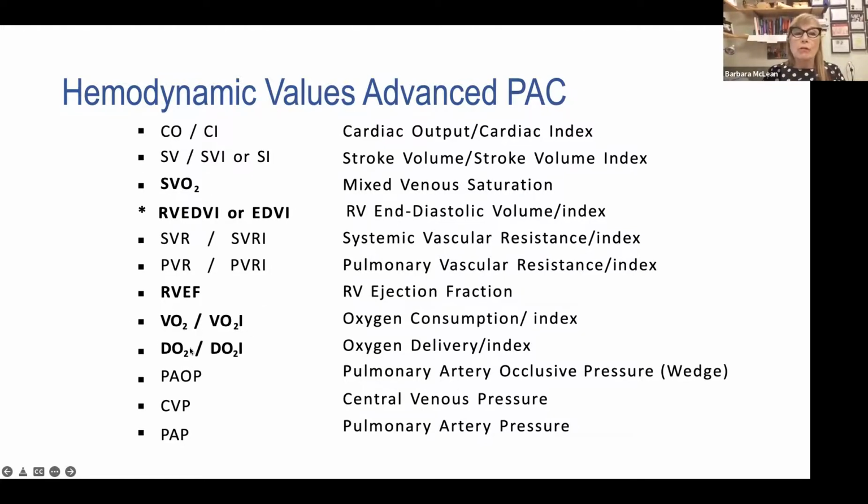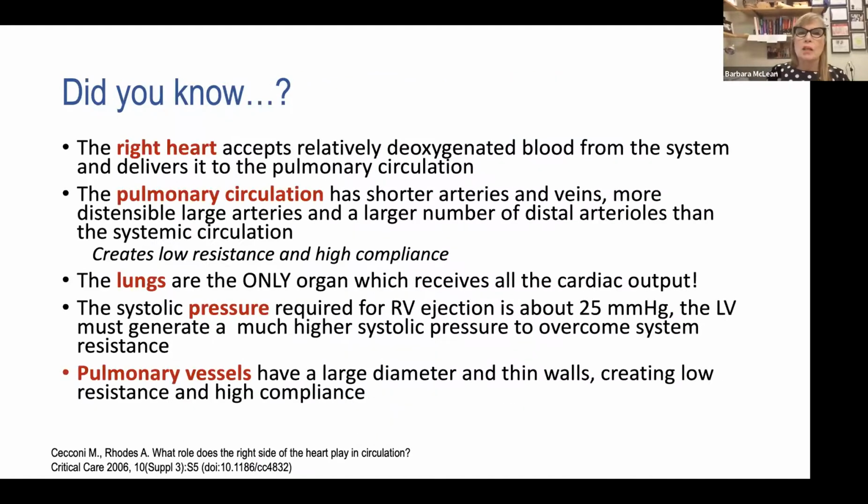The advanced catheter information is highlighted or bolded, and this is automatic information that's being gathered by your monitoring capability when you have continuous SvO2 and continuous cardiac output, which means the human factor that can affect the value of what's being read and understood is reduced. It doesn't mean that nurses didn't do a great job. It's just we've reduced the human factor in the science.